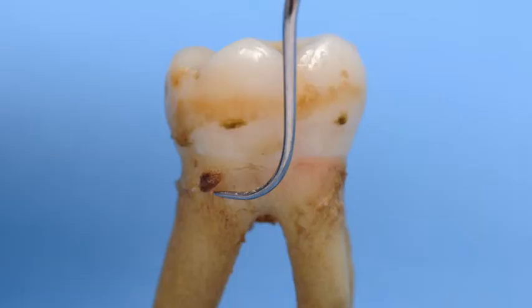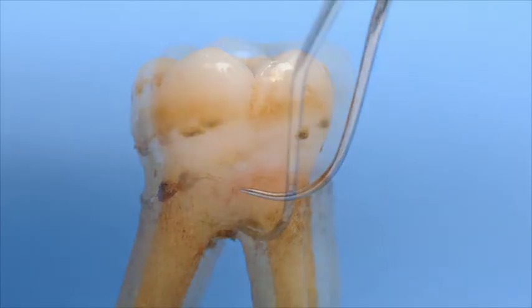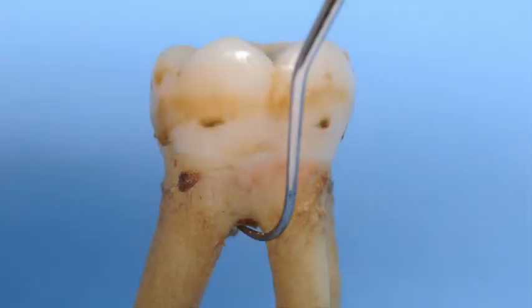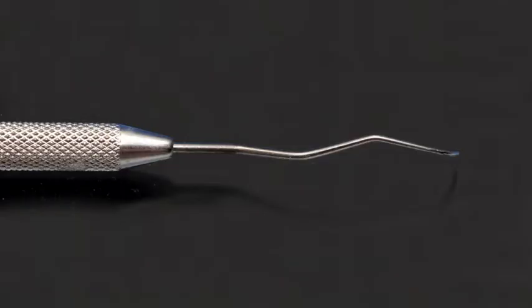The ODU-1112 Explorer is a highly effective instrument for supragingival and subgingival assessment of periodontal tissues, tooth anatomy, and the texture of tooth surfaces. The ODU-1112 Explorer's shank is designed to mimic an 1112 Gracey curette and the universal characteristics of a Columbia 13-14 curette.